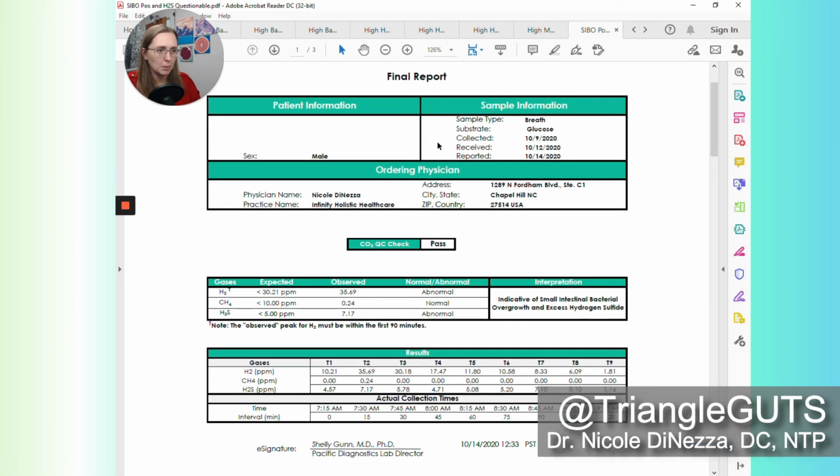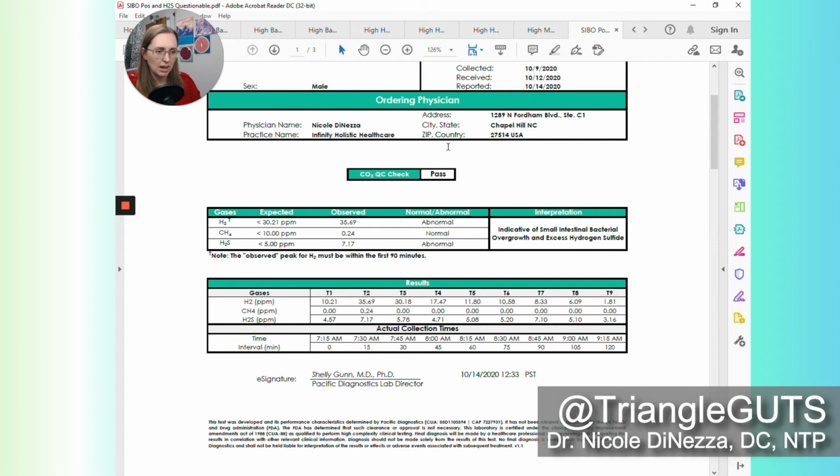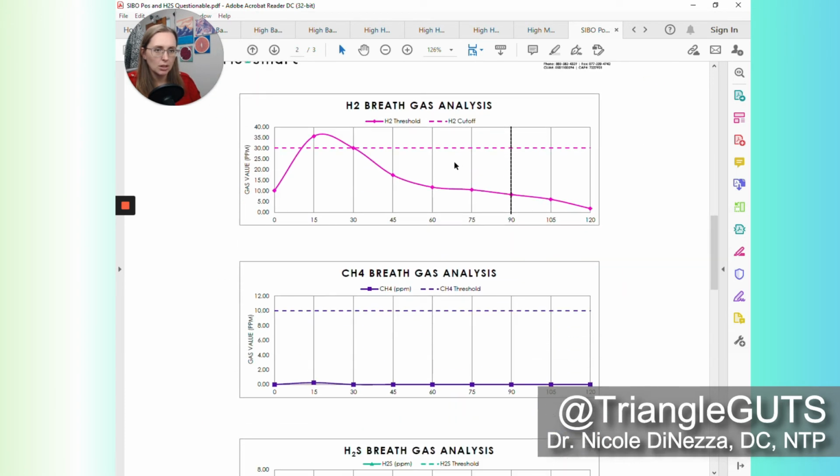Okay, yet another one. All right, this is a glucose test, and we can see no invalid samples, so we're going to march on. Clear as day. This is SIBO if I ever did see one. Look at this bad boy. We go from 10, and then we jump all the way up to about 35, and then we come back down to 30, and then we gradually peter out.